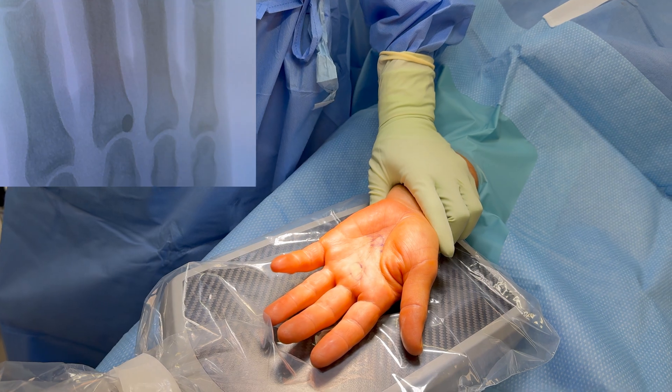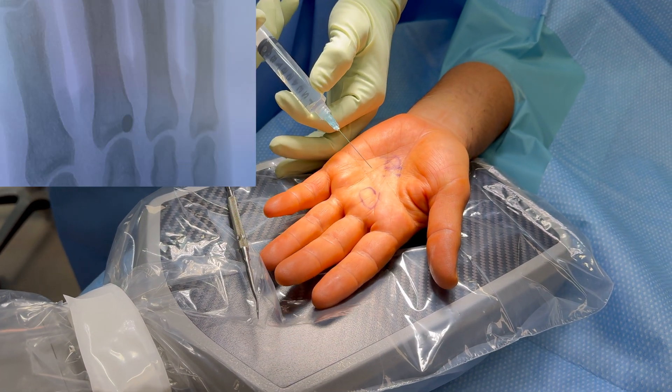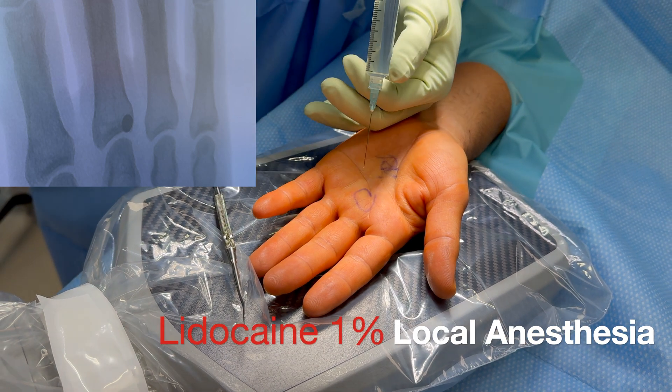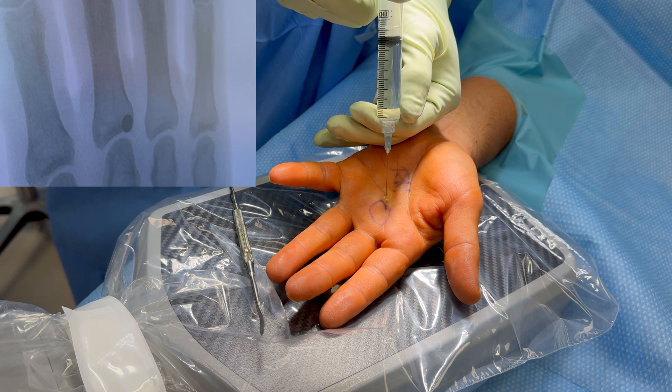Here we are taking an x-ray to find the pellet and confirm its location, and then we are going to inject some local anesthesia to help with the pain so that we can do the procedure without pain.